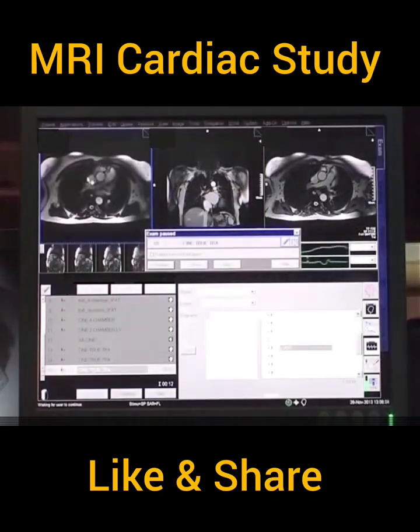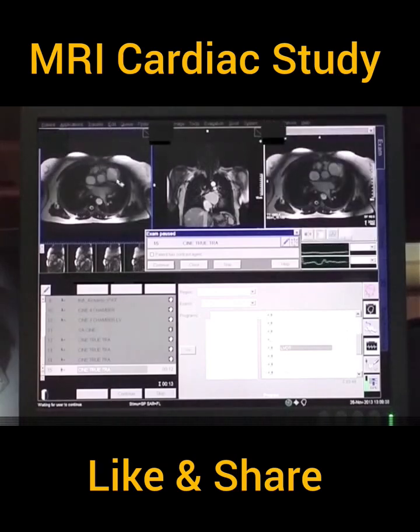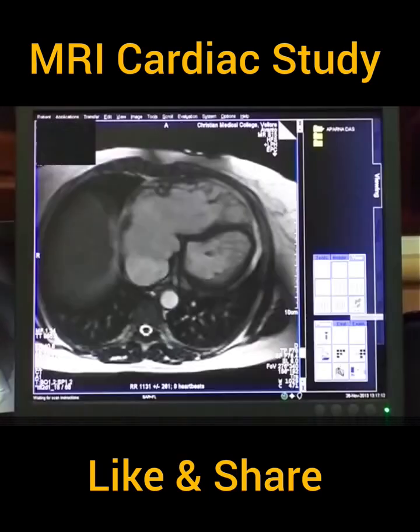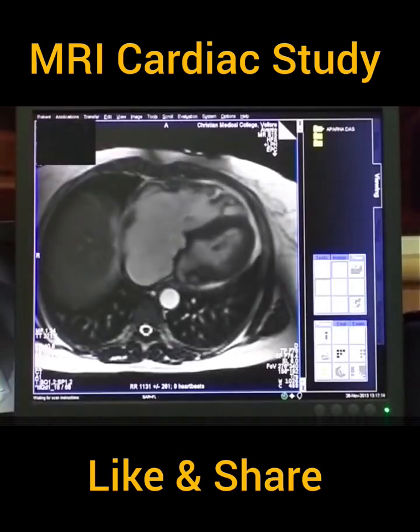This is the SVC, the ascending aorta, the RVOT, the right pulmonary artery, and the descending aorta. This is the dilated RVOT, the right atrium and right ventricle are moderately dilated. There are crenations on the RV wall. There is focal aneurysmal outpouching and areas of dyskinesia.